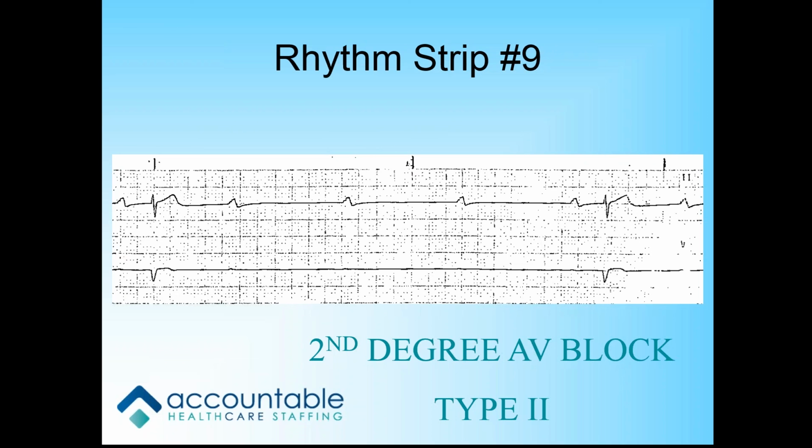Well, wouldn't we shock them? You want to pace them? Think about what shocking does. Oh, well, I guess that's true. So yeah, you would want to pace them because you would want to increase the QRSs. You're going with your Ps.